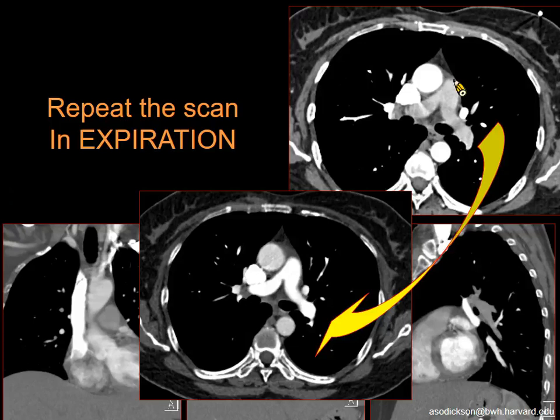At our place, we do our PECTs with a small amount of IV contrast, usually 50 ml at 100 kVp. So I have no problem, in a patient with normal renal function, giving them another 50 ml to answer the clinical question. The radiation dose I'm also not terribly concerned about because we've brought our radiation dose down so low, partly by using 100 kV imaging, that I would rather give a little bit of extra radiation in these patients to answer the clinical question. Otherwise, we've done a completely useless exam with no benefit to the patient.